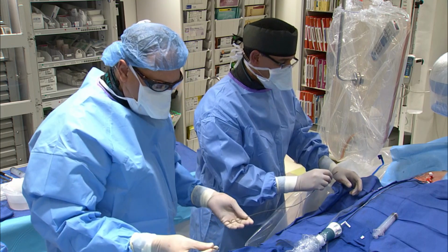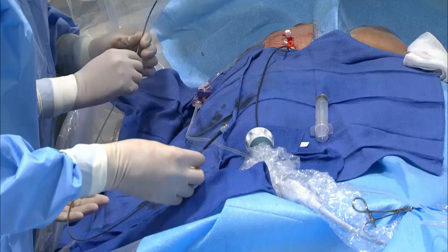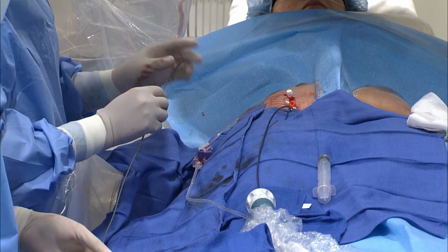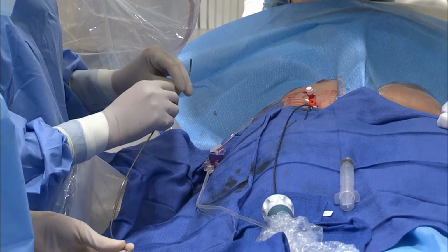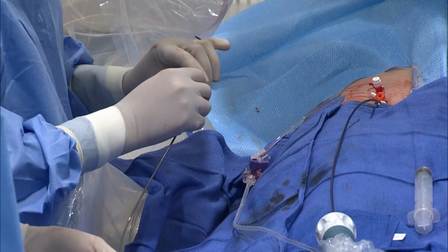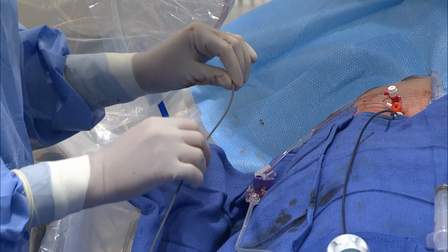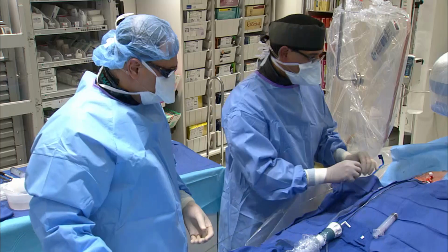Okay, so Andreas, you want to talk about this catheter a little bit? So this is a Goodale Lubin catheter. It's a woven Dacron catheter. And the reason I like it is you don't need a wire to lead it like you might with others, and it is torqueable and is easy to cross and get into the pulmonary vein. So we'll go ahead.